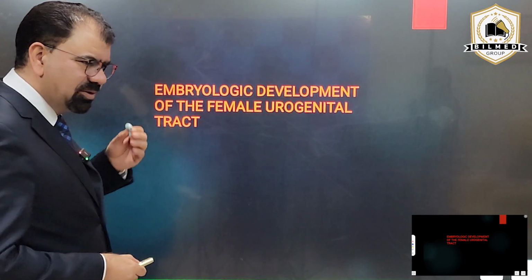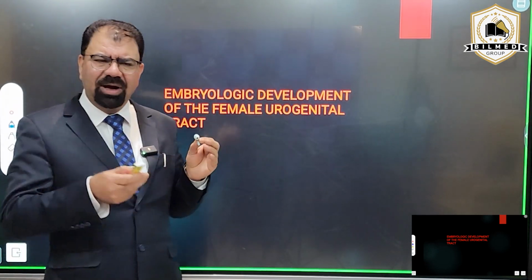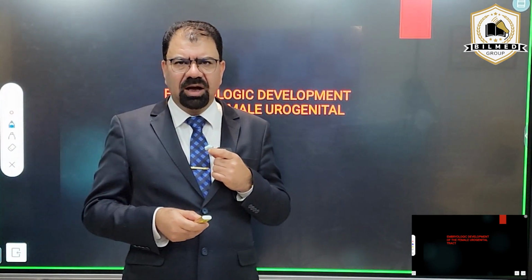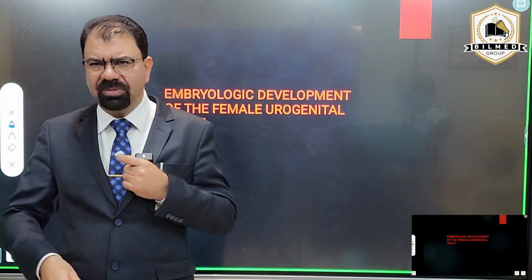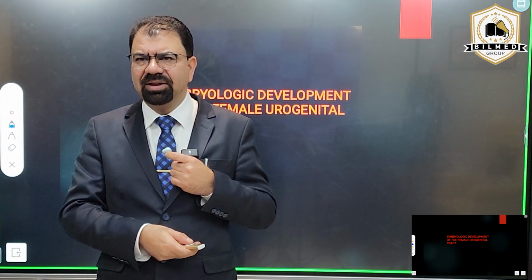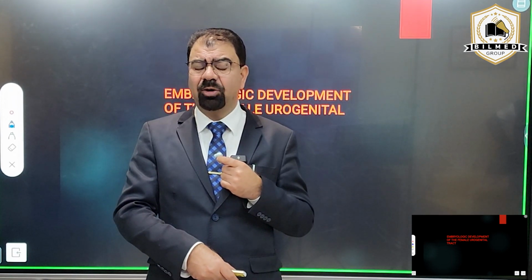The point here is that, first of all, you have to keep embryology in your mind when you are putting a probe onto the female pelvis, because in embryology we know that the uterus has a relationship with the KUB, I mean the kidney. If there is something abnormal in the kidney, there is a possibility that an abnormality in the uterus can be there, and vice versa also. What it means is, if you are suspecting a bicornuate uterus, don't restrict your scan onto the uterus only, slide up and see the kidney.